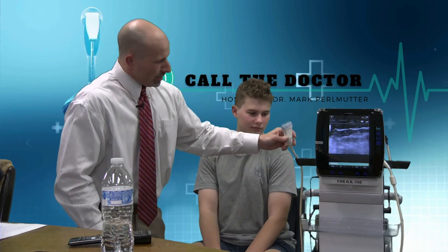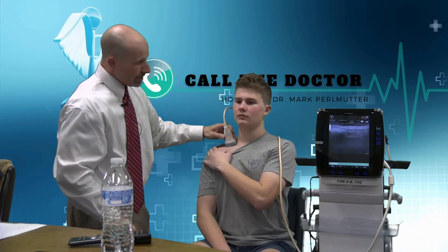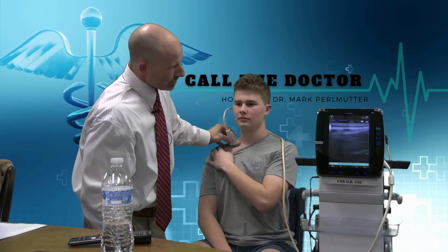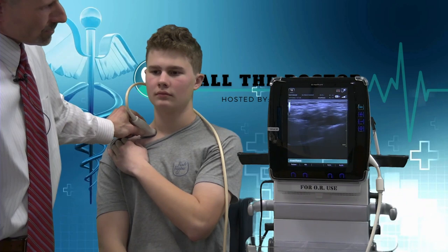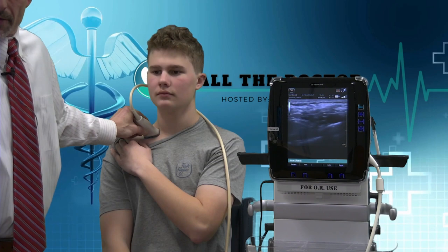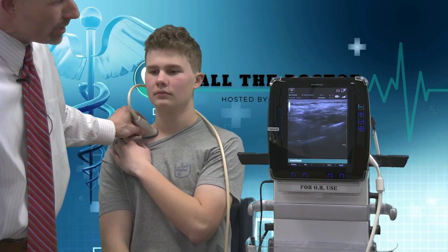This is the probe — you simply place it lightly on the patient's skin. When we say supraclavicular block, that means above the clavicle. He's aiming that probe at the bundle of nerves that come out of the neck, go under the clavicle, and then go into your arm. He leaves the probe in place as he inserts the needle for the block so he knows exactly where he's putting it. He finds his image, and what he always wants to find is a blood vessel — an artery that you can probably see pulsating on the right-hand side of the screen.